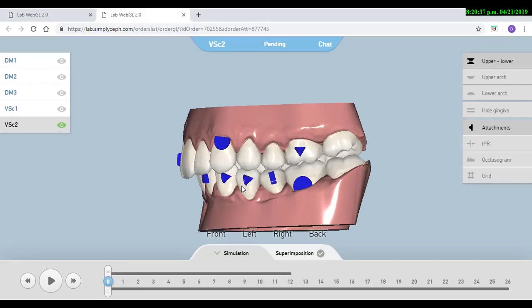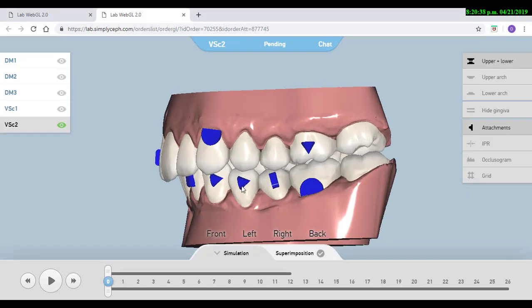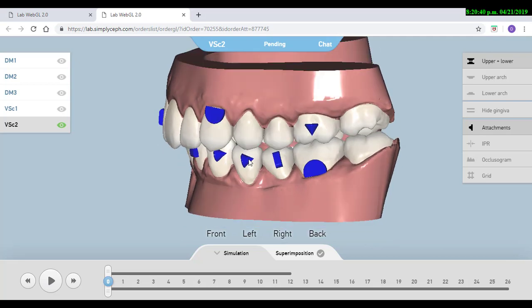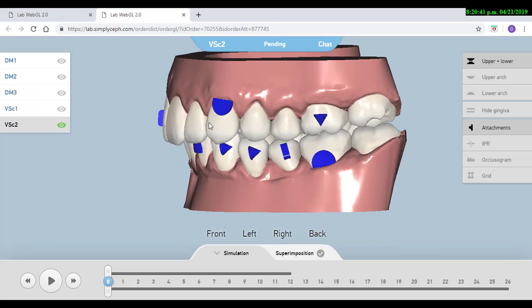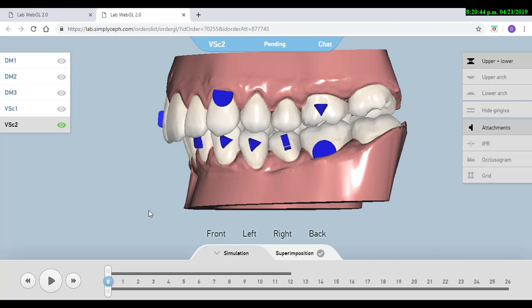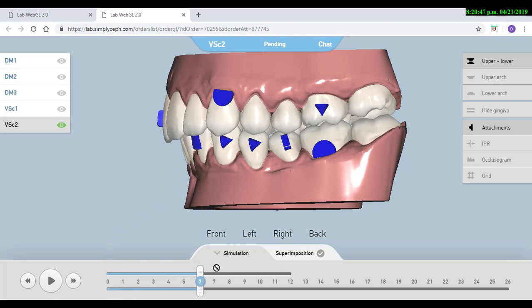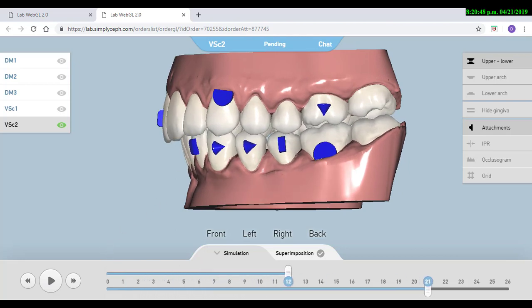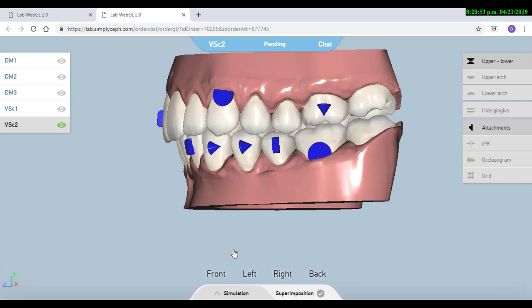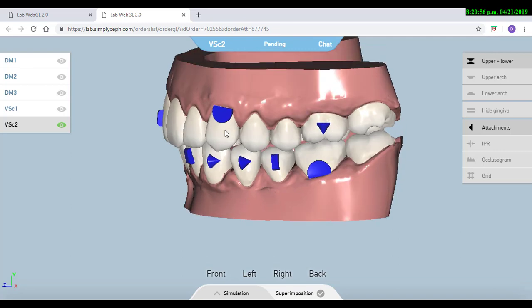It is important that the virtual bite jump will be a simulation of what the elastics are going to do on that patient. To see the amount of jump, we just need to go to the final position and then we move to simulation and we make a click, and that is going to show the jump that we are performing.